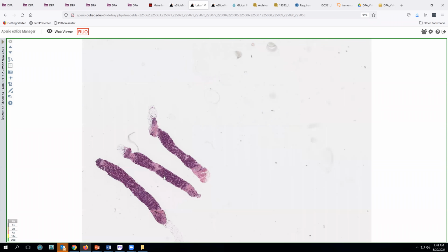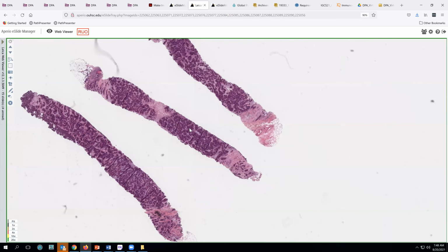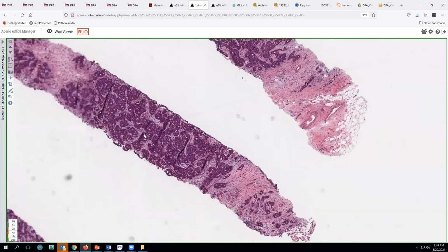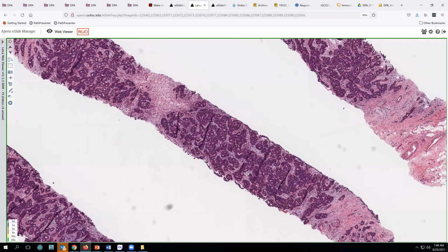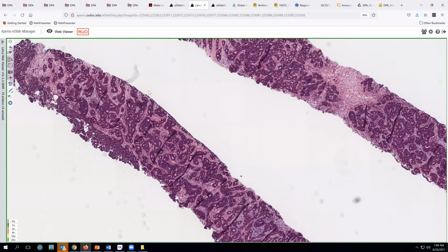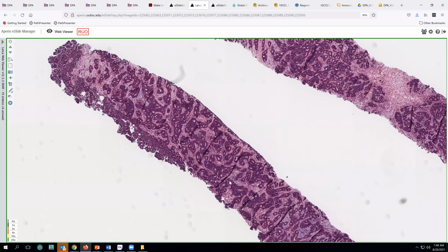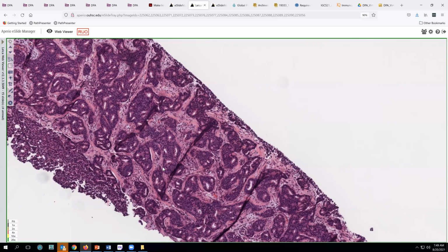Okay, let's move on to another case that came in the same day. And this is, I think, a very interesting case because of the differential that it presents. Again, we see a very blue tumor, very sharp boundaries. And looking at this tumor, we see a fair degree of open spaces in these puzzle pieces. But notice one other thing here.